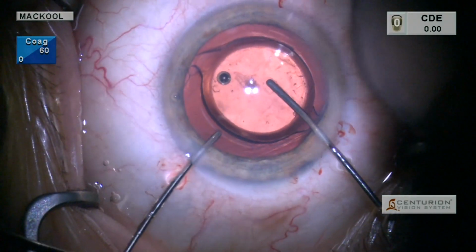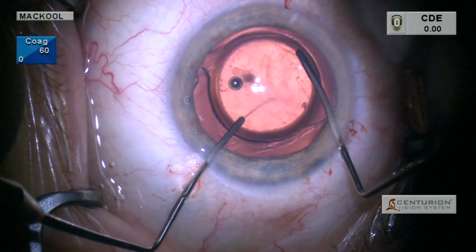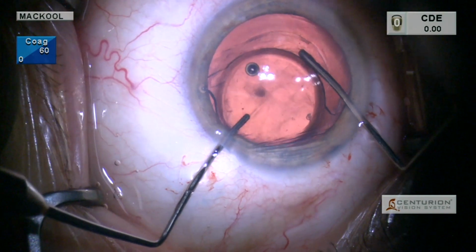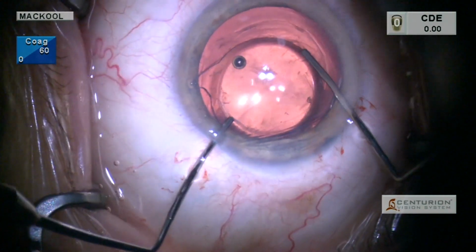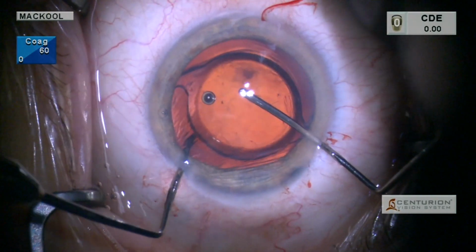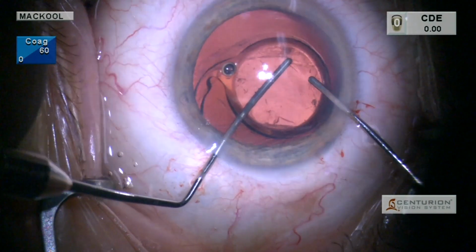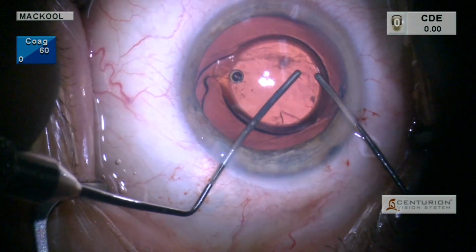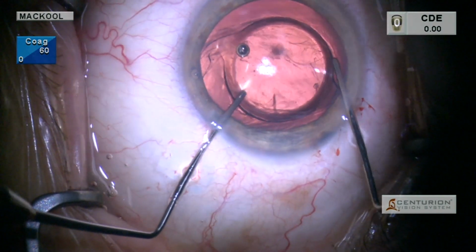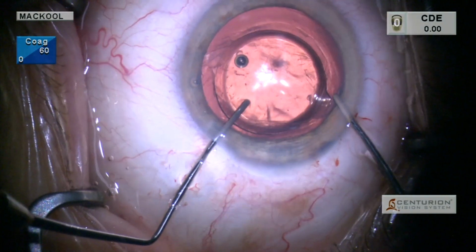Checking over here. Now I'm going to try to get this spatula underneath again, and using the spatula from the side, again trying to get this optic to shift anteriorly to the rhexis. Looks like we're just starting to get it there to be anterior on that, what is the nasal part of this eye.